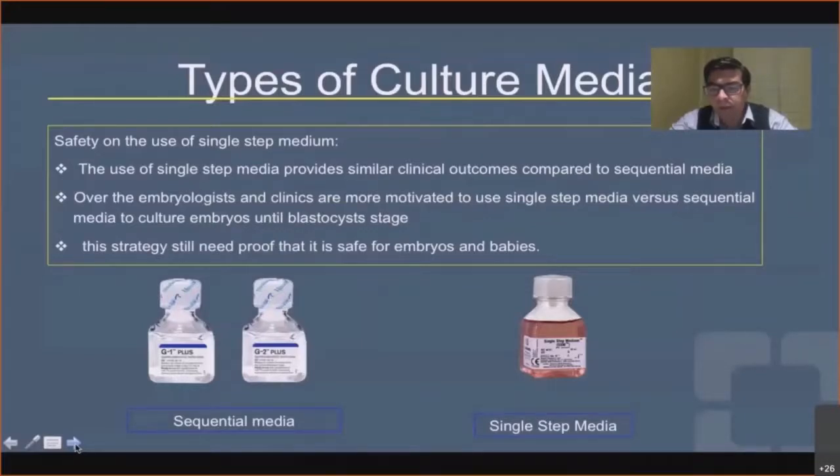I would like to mention that we don't have a time-lapse system in our IVF laboratory. For example, when we need to perform blastocyst biopsy, we perform the zona drilling at blastocyst stage just before the trophectoderm biopsy. And following this scheme, we only grade the embryos at day 2 of development and at blastocyst stage before the embryo transfer or before the embryo cryopreservation.